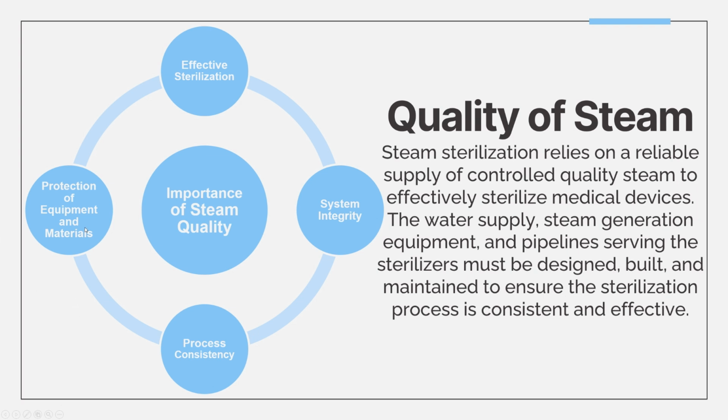So poor steam quality doesn't just affect efficacy of sterilization. It also damages sensitive instruments and even packaging materials. So, for example, excessive moisture can cause corrosion or staining, which shortens the lifespan of devices.